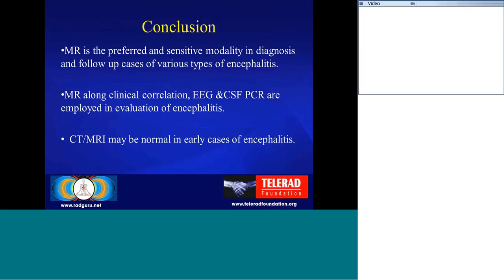So the clinician should always do a CSF study with a viral titer of the CSF, and also EEG studies, and also assess how the patient is clinically. On follow-up after 3-4 days, the MR may be positive in some cases.